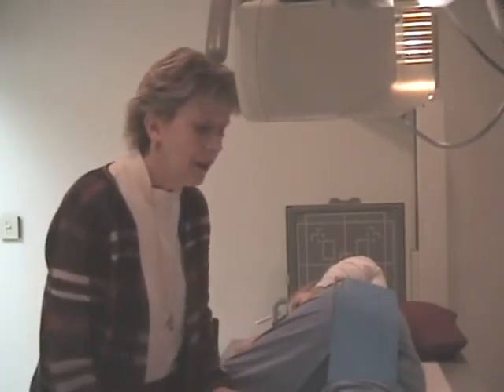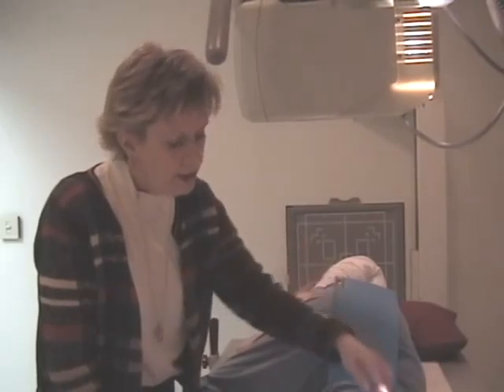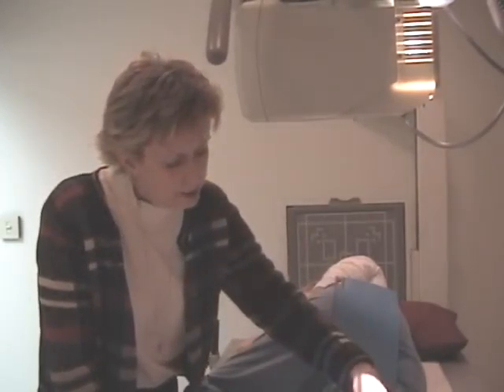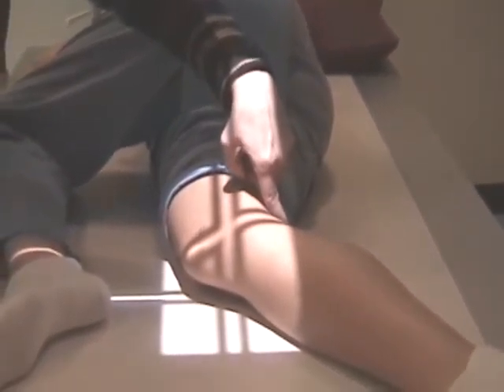When the leg goes into a flexion mode, the patella actually floats down and it doesn't maintain that same relationship with the joint space. So I have another trick that we're going to show you to help you get the center of the film to the joint space. You're going to make a T with the lower leg, and part of the start point is at the cross of the leg, right here, where the leg is bending. Okay, you see that?